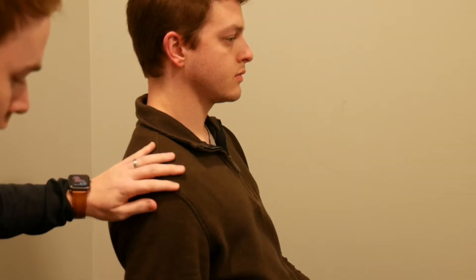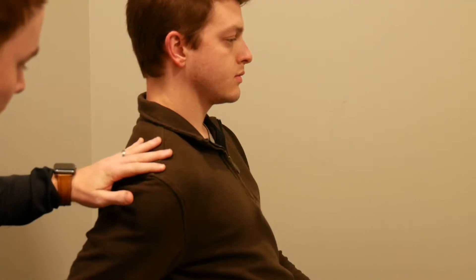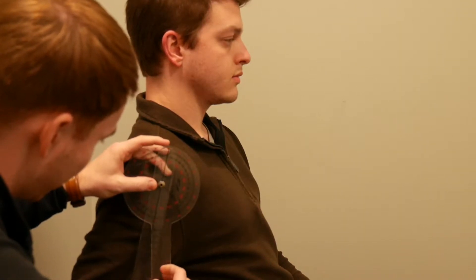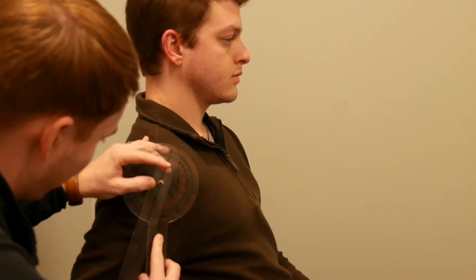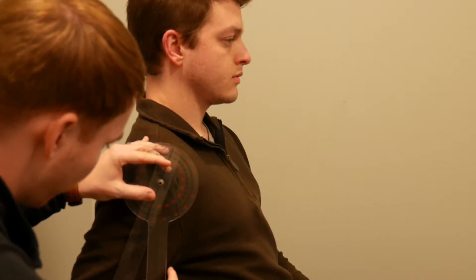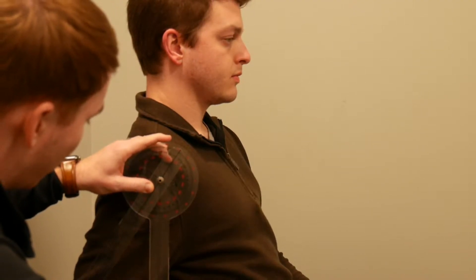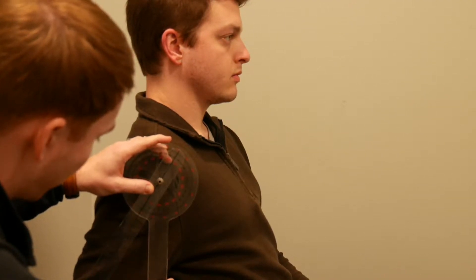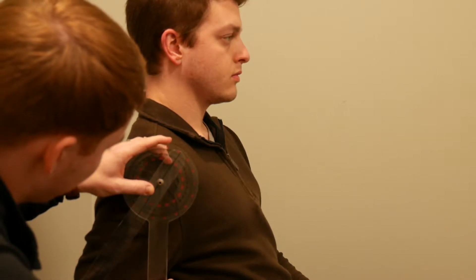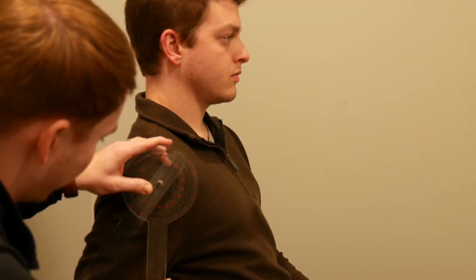We'll ask the patient — Dylan here — to reach behind him as far as he comfortably can. After he does that motion, I'm going to place the goniometer right on the acromion process, make sure the stable arm is going straight to the floor at a 90-degree angle, and then the movable arm will be placed right in line with the humerus, and you'll get a measurement of about 35 degrees.